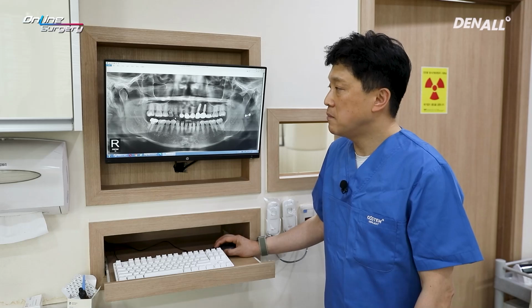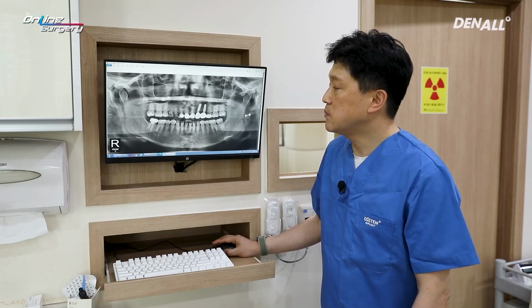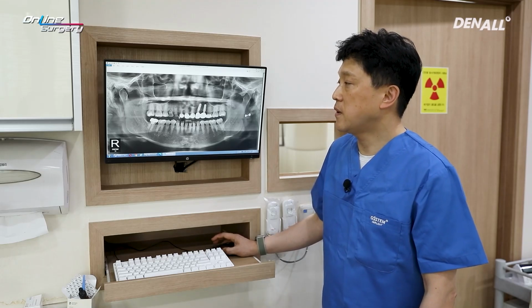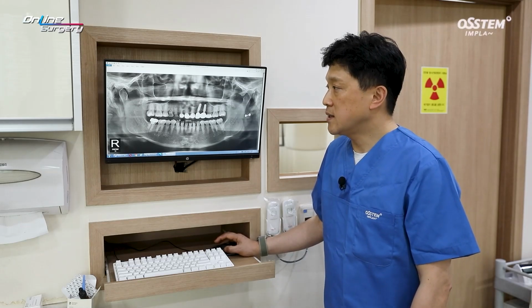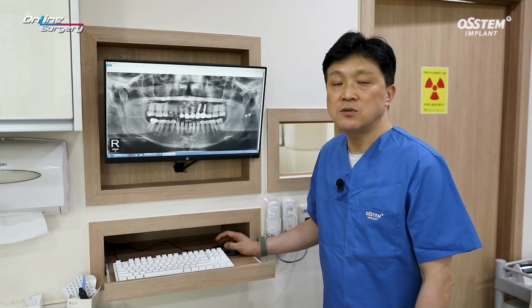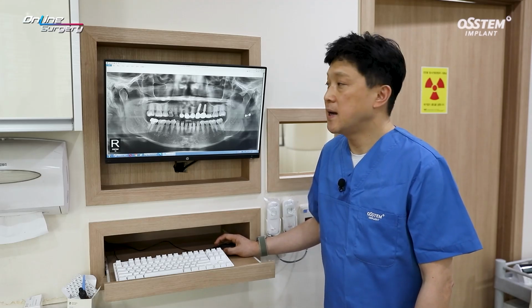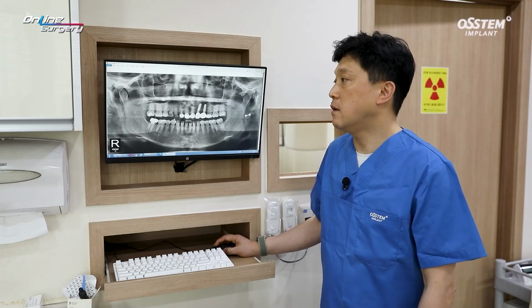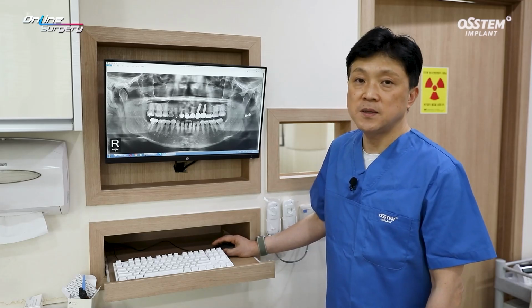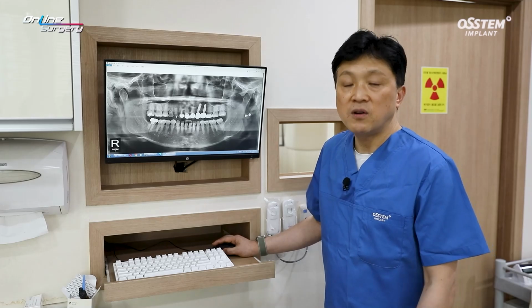The patient complained of pain in teeth number 54 in the number 14 tooth area. We could not wait longer and implant placement was decided. When we come across this kind of patient, permanent teeth were congenitally missing and there were prolonged retained primary teeth. In this case, bone may be immature in a lot of cases. You can anticipate a thin ridge, and there can be difficulty in implant placement due to horizontal bone insufficiency.